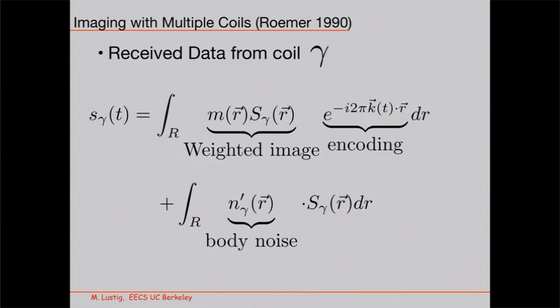It looks at the hardware of it, but also what do you do with the data that comes out of it? Okay, because it's not trivial. I mean, okay, so I got these 8 images. What do I do with them, right? There must be some way to optimally combine them somehow, right? I mean, there's trivial ways, and then there's maybe an optimal way, and those depend.